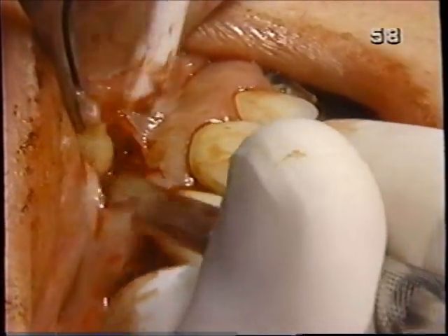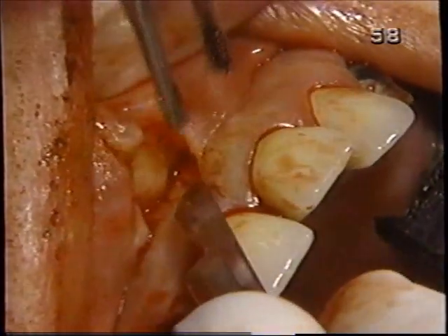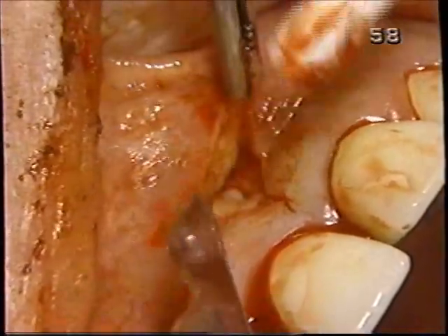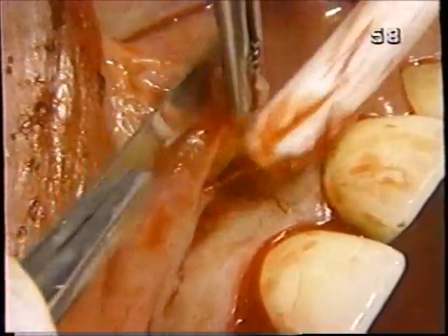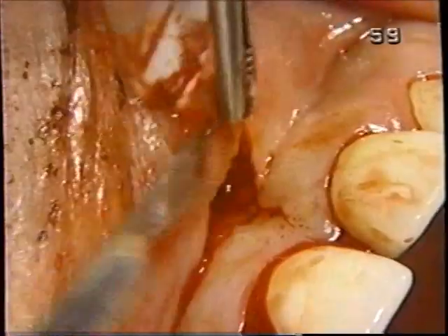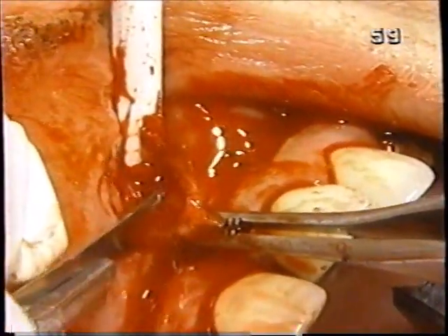We'll go ahead and excise the frenum, and then connect the 2 cuts that we just made. Pull it. Okay.